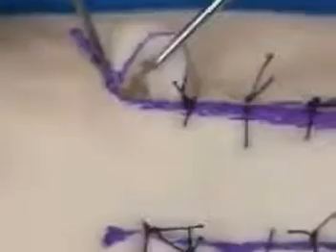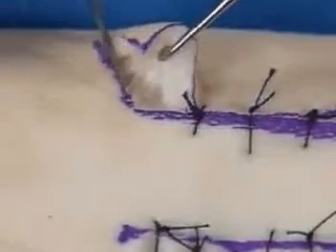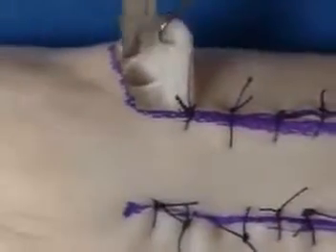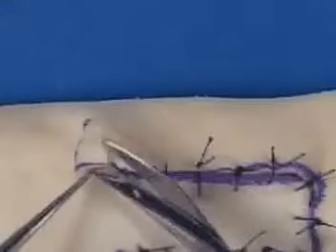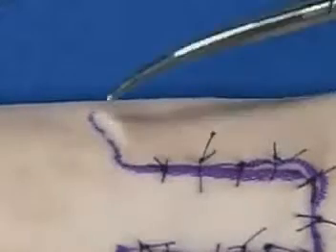It is then marked with a surgical marking pen. An incision is made perpendicular to the skin edge so that we can mark out the point of a triangle. Undermining is done under this dog ear deformity. The skin is transposed back until one can exactly see how much skin is needed to be trimmed.